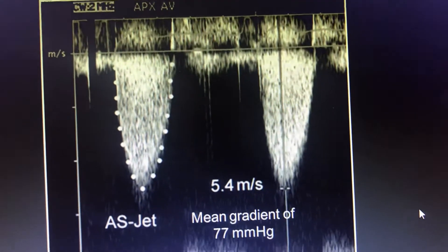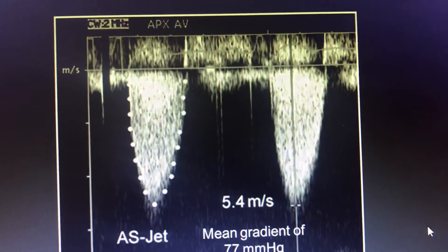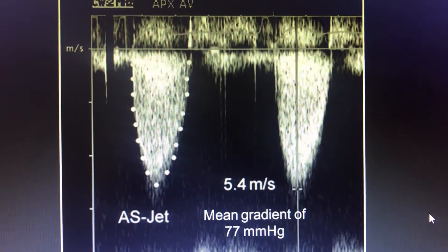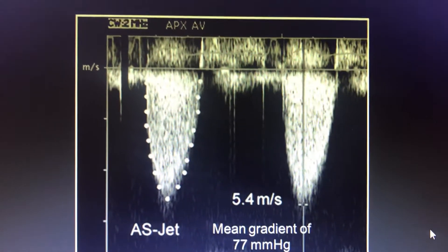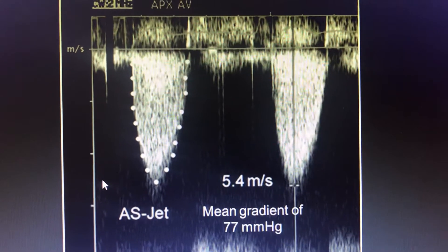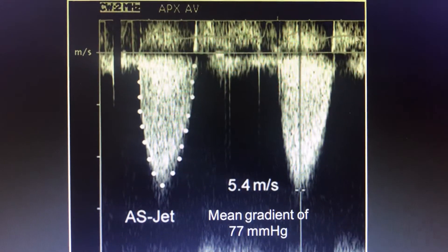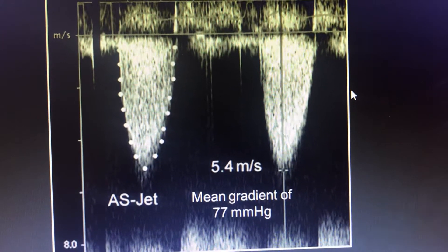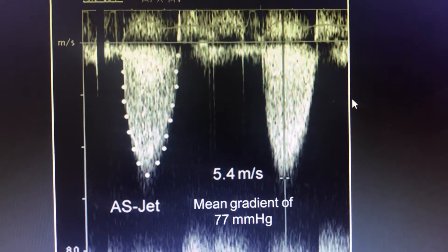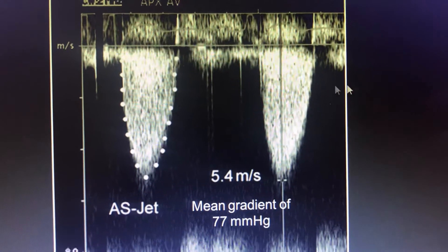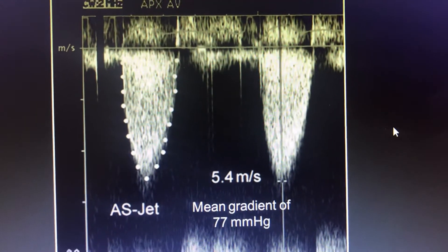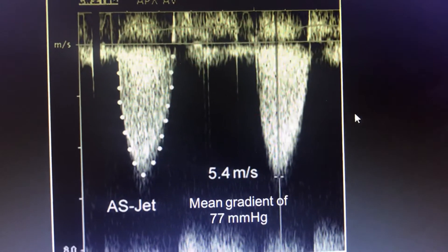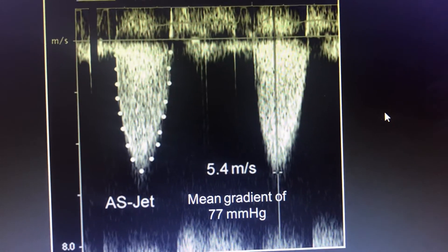Let's get into the measurement of the aortic valve area and gradients for aortic valve stenosis. The continuous wave Doppler is taken in the apical view. From the short axis view, going counterclockwise up to 180 degrees gives you the apical 4-chamber view. In the apical 4-chamber view, you place the cursor on the aortic valve itself — not in the LVOT. Placing it in the LVOT gives the LVOT gradient, which is a pulsed Doppler measurement.